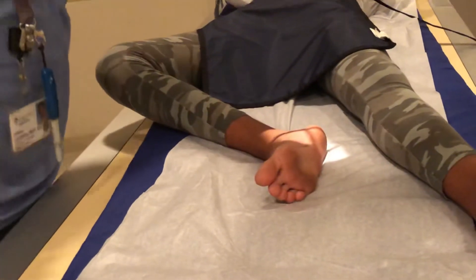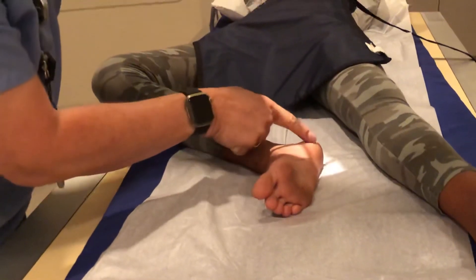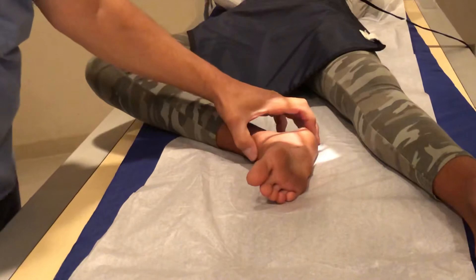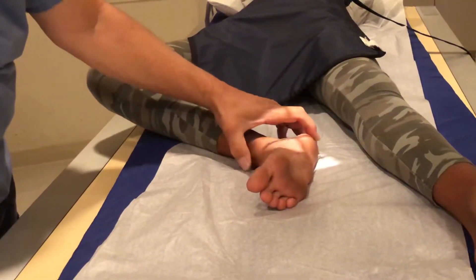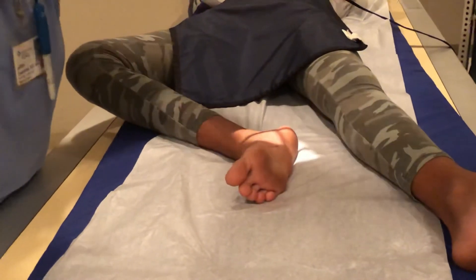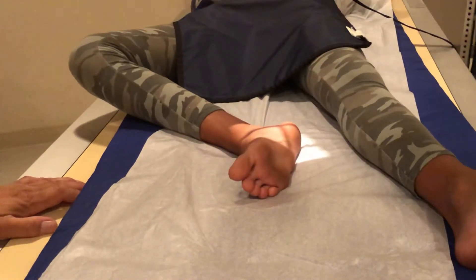And you can come down pretty tight also — it's almost a 45 degree angle, but you want to enter — you want the line to go from here to about here where the foot and the lower leg, the ankle, intersect. So you're going to shoot it like this, add your marker, and you're all done. And those are the two views for the os calcis.